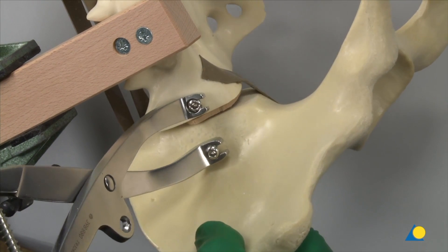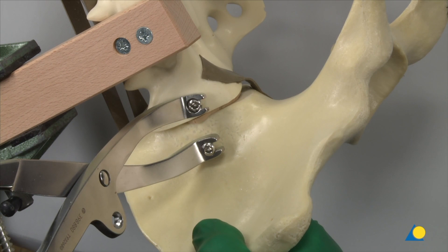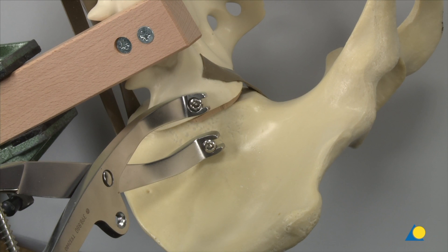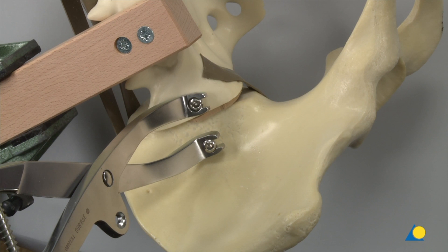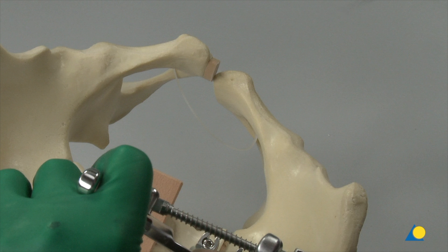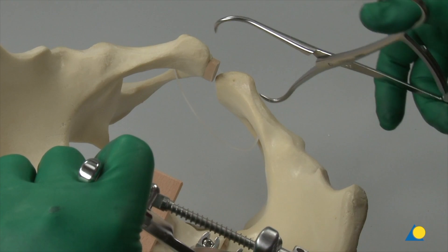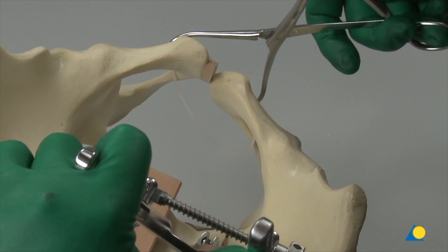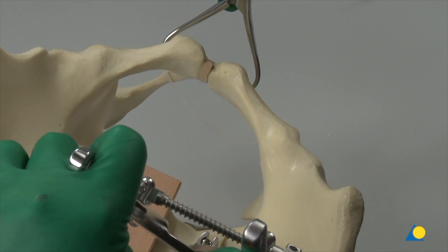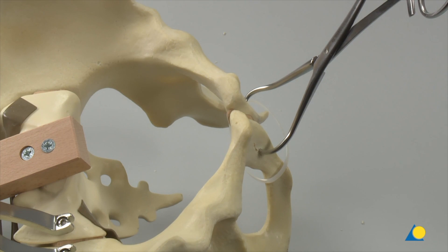The correct position of the K-wire can be controlled directly after having distracted the joint using the clamp. With the Jungblut clamp alone, correct reduction with respect to a flexion-extension deformity may be difficult. To make sure that no flexion-extension deformity persists, the anterior part of the pelvic ring is exposed through a Pfannenstiel approach. Reduction is then completed by means of a pointed reduction forceps introduced either into the obturator foramina or into the pubic bodies.